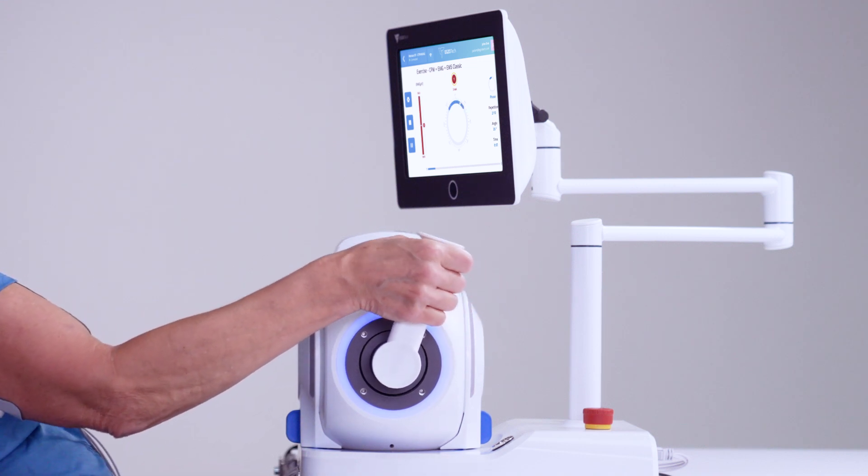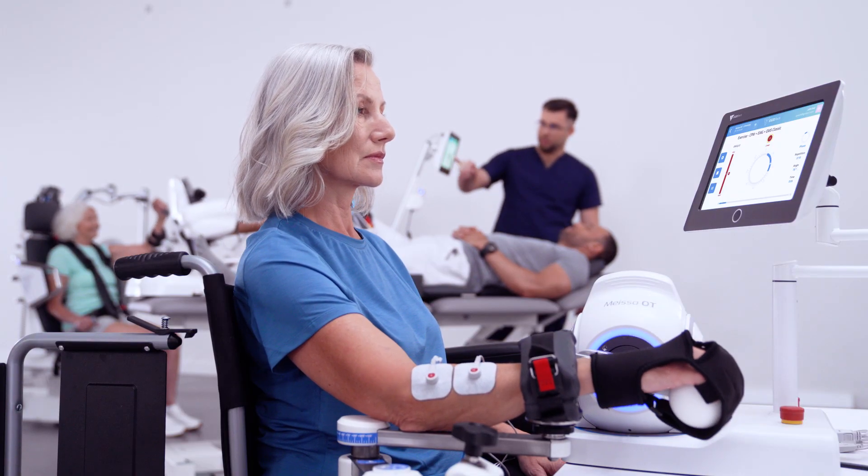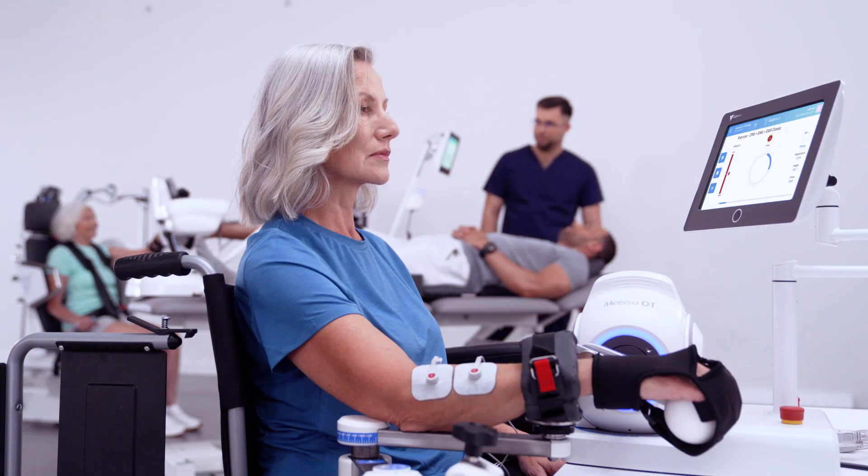Designed to improve muscle activity, range of motion and strength, EMG-triggered movement with EMS stimulates neuroplasticity and leads to recovery.